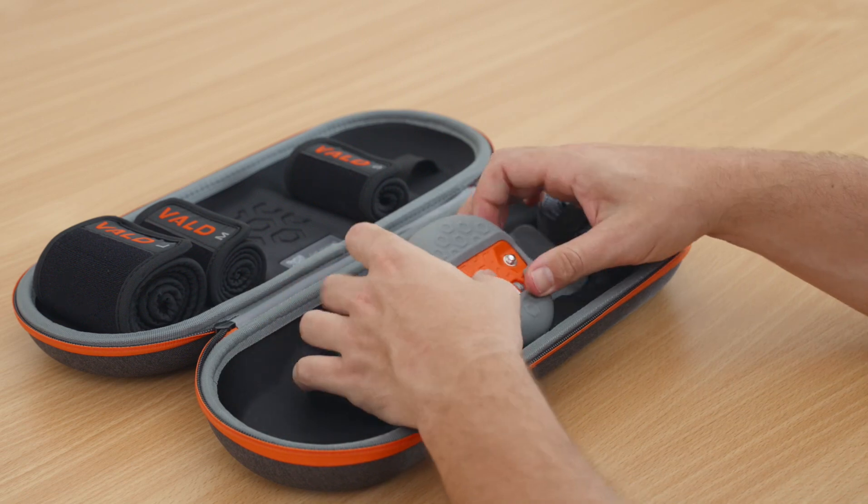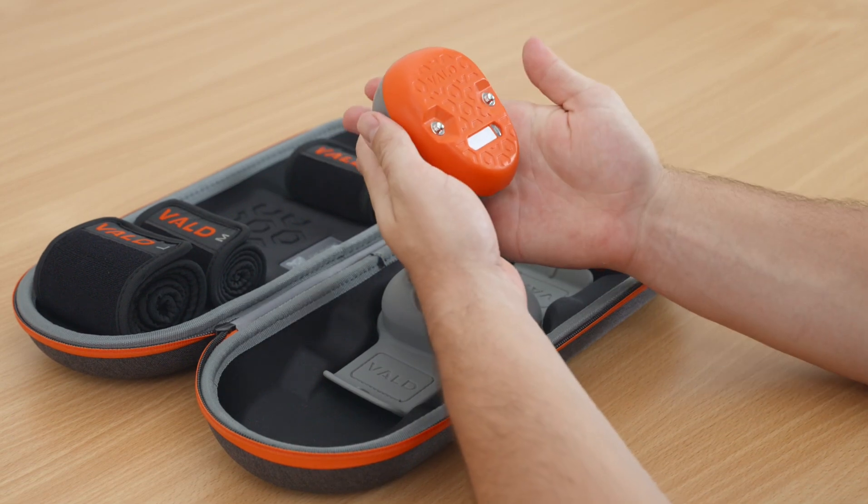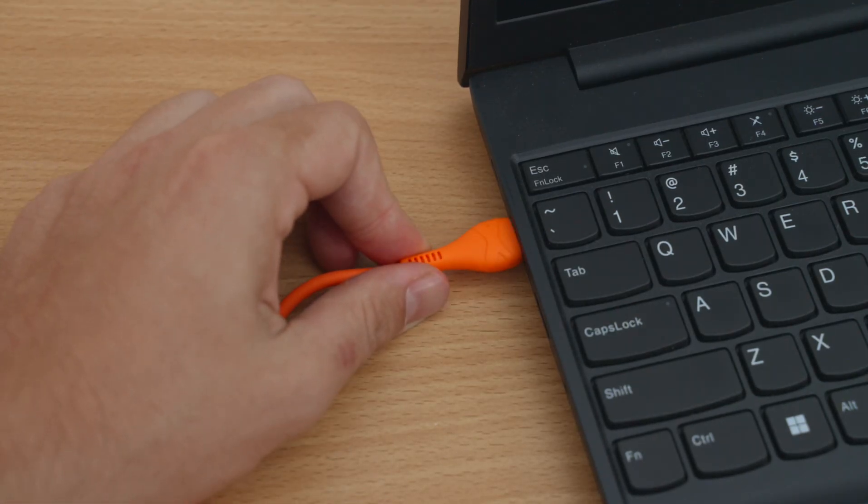The Dynamo Lite unit arrives with a small amount of charge so that you can get familiar with your device upon arrival. Use the enclosed USB-C cable to completely charge your device.